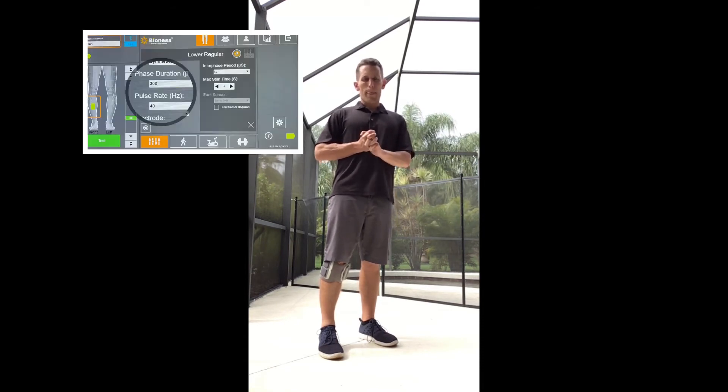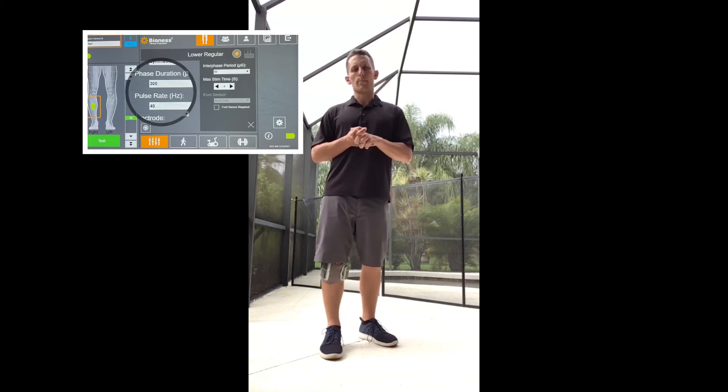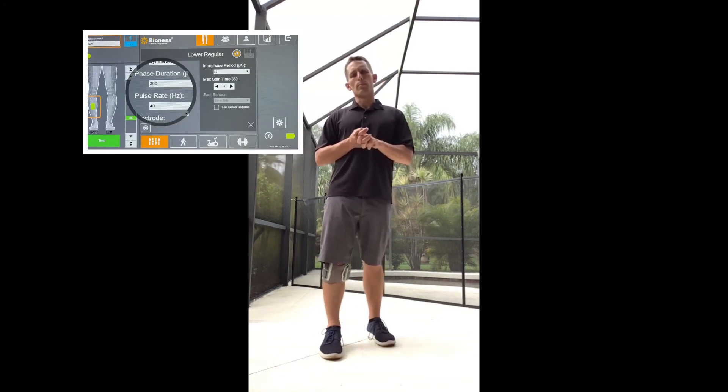Also on that first test screen, we have pulse rate that defaults at 40. We can increase it if the patient has more impedance from swelling and we need to create more power. We can decrease it if the patient fatigues easily, or if they're a pediatric patient or a patient with an MS diagnosis — we will often decrease the pulse rate to decrease fatigue.